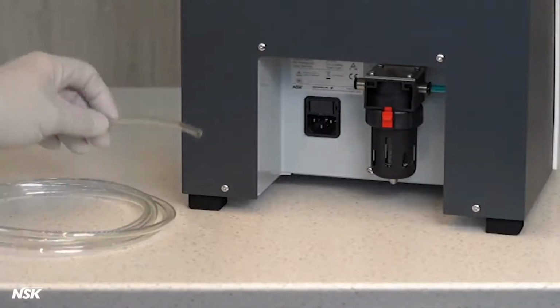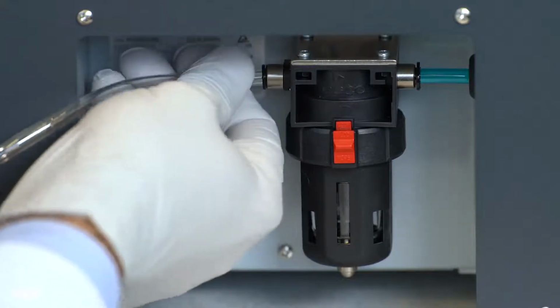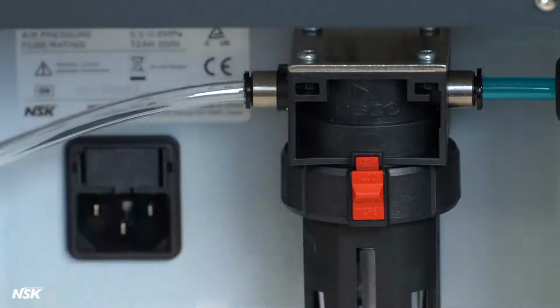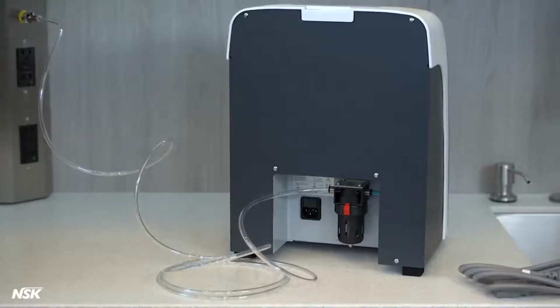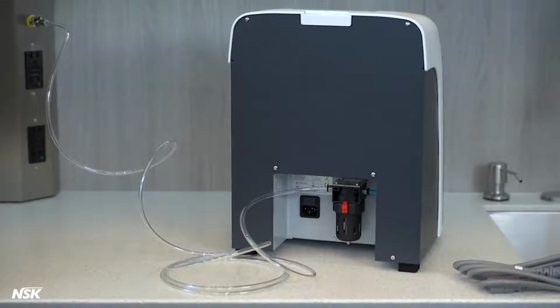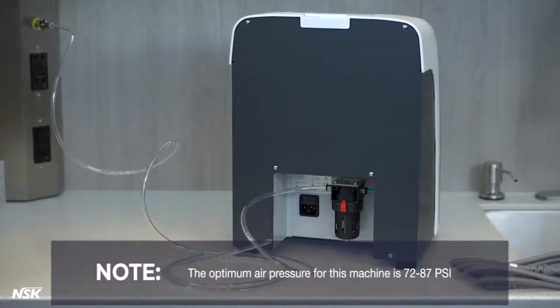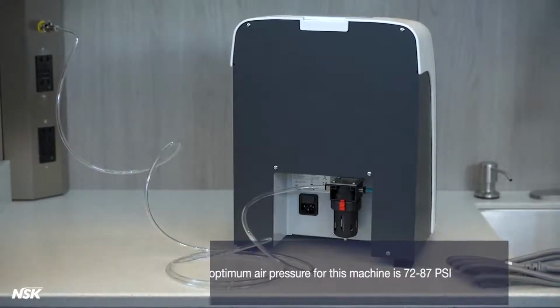Once you have the tube connected to the air valve, insert the opposite end of the tube into the air filter located at the back of your iCare. Check the connection with a slight push and pull. Next, open the air valve to check for any air leakage sounds. If the connection looks and sounds good, then roll up the tube and store the tube behind your iCare. Note: the optimum air pressure for this machine is 72 to 87 psi. The air should be clean and dry.